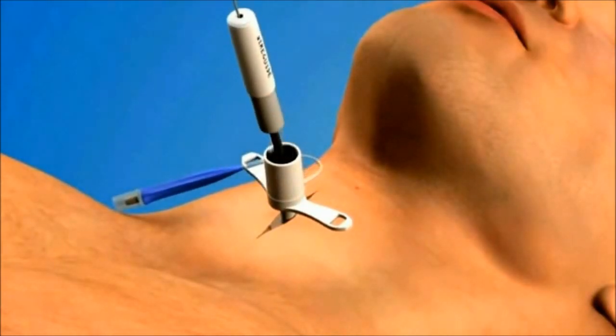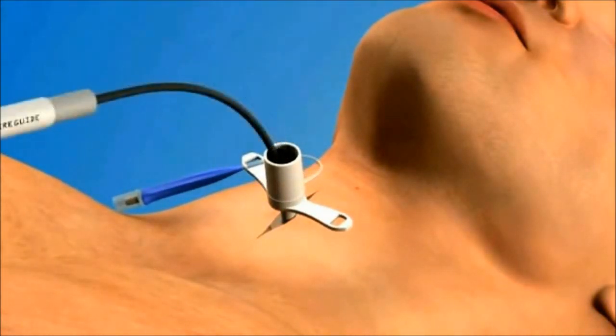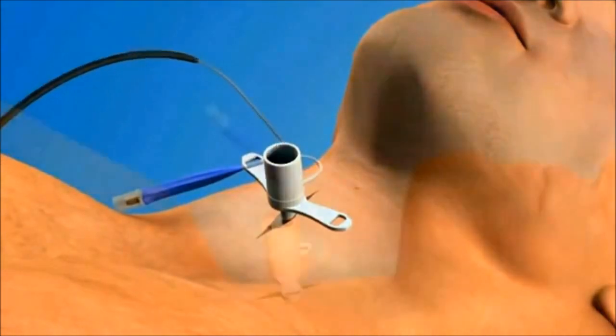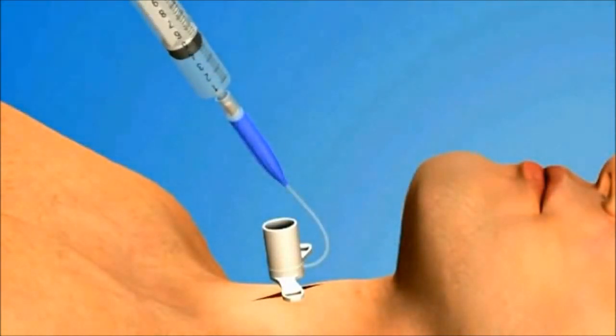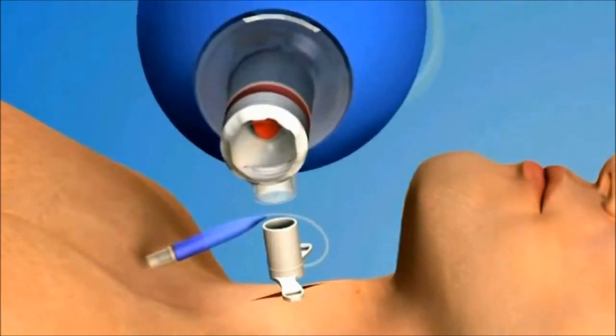Simultaneously remove the guide wire and the dilator from the catheter. Inflate the cuff with 8-10 milliliters of air and then begin to ventilate the patient.